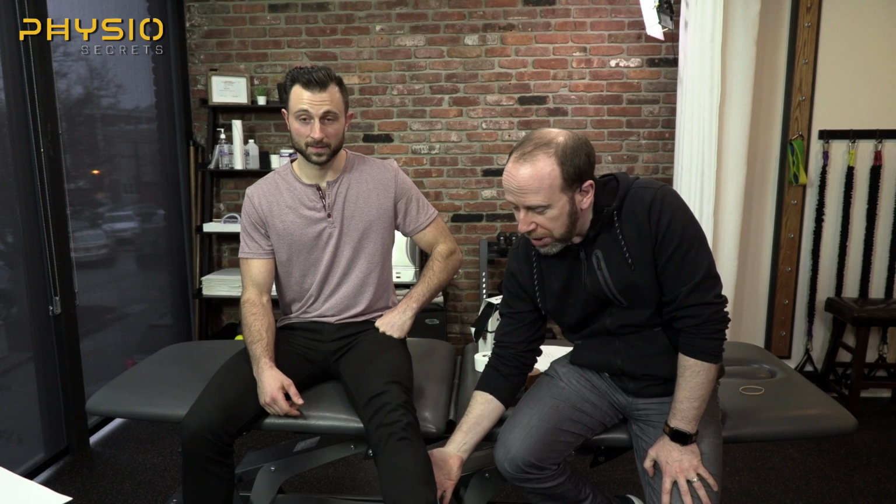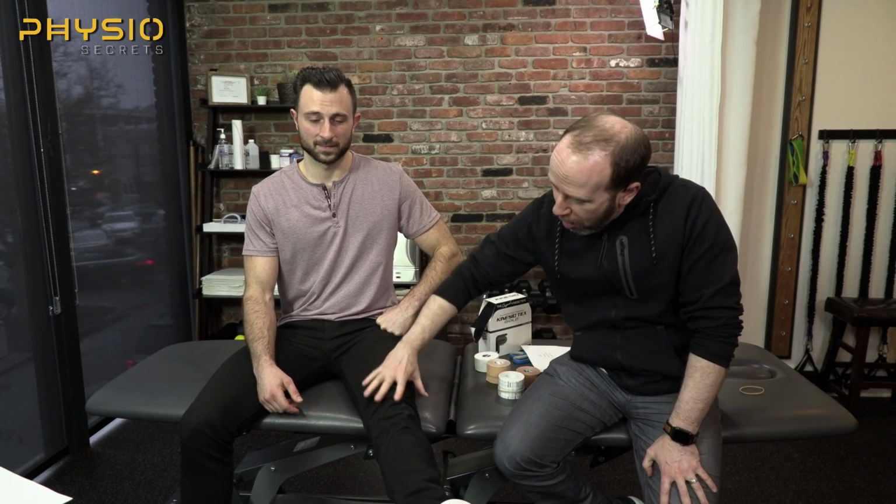I don't know if you guys can see. Andrew's got black pants on, but I want you to just straighten your leg out. And you'll notice that his pants start to pucker. See how the pant leg puckers? Maybe you can see it on mine. You see how here we get puckering in the pant leg? The general idea here is that when you're applying tape for swelling, you want to create that puckering effect. So if I was applying tape to block motion or support his quad, I would pre-position the leg in extension, tape over the leg so that when he bent the leg, the tape goes on stretch.